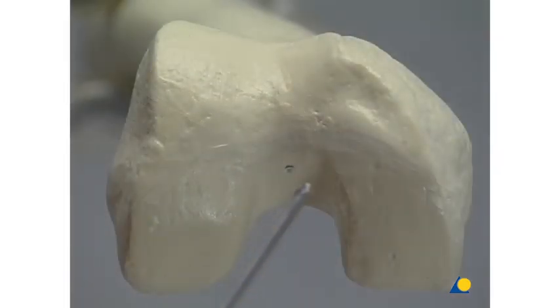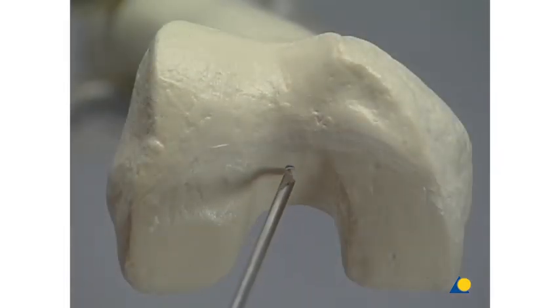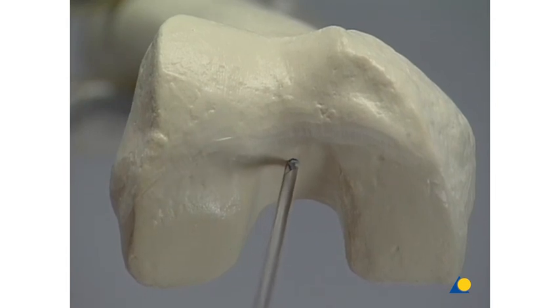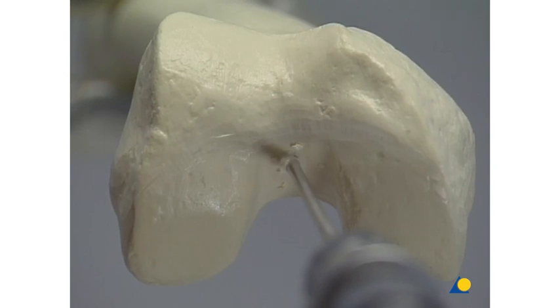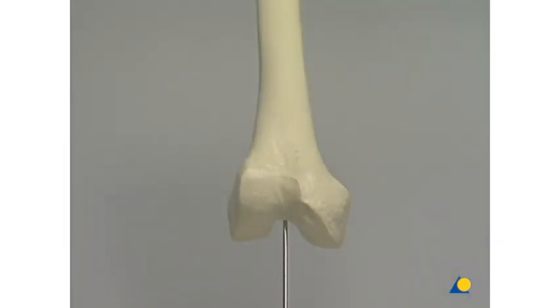The guide wire is inserted 10 to 15 cm into the medullary canal in the AP direction and in the sagittal projection along the axis of the femoral shaft. In doing so, the 7 to 9 degree valgus angle of the axis of the femur must be considered.